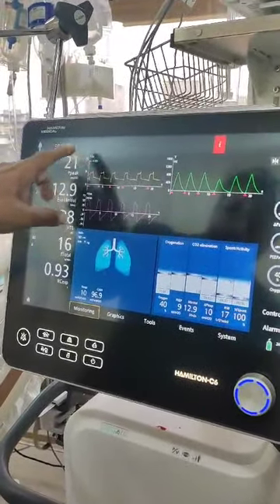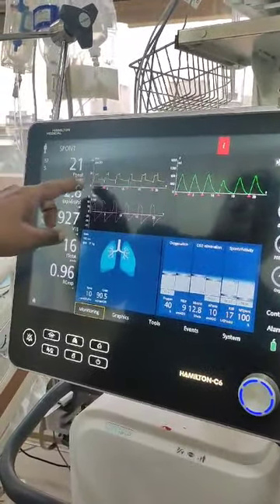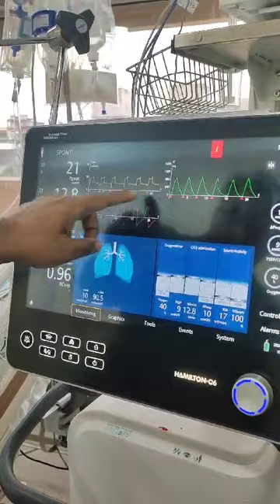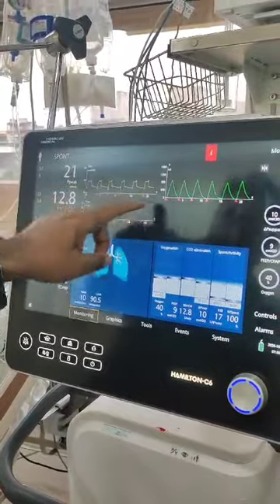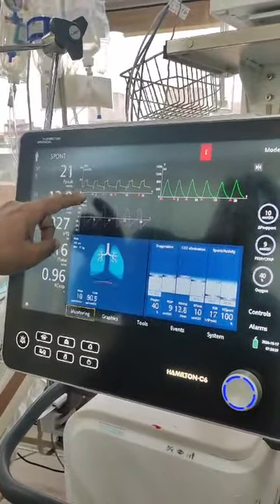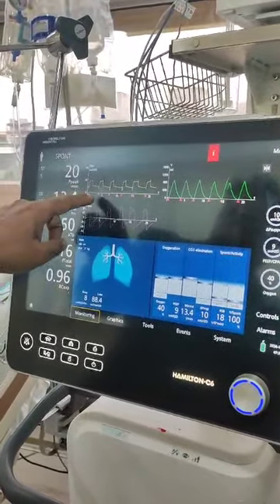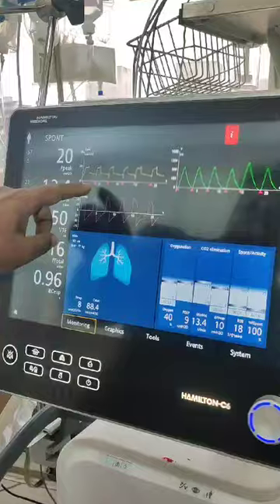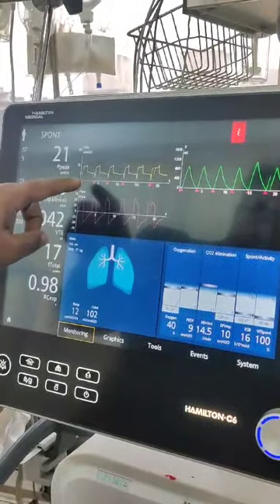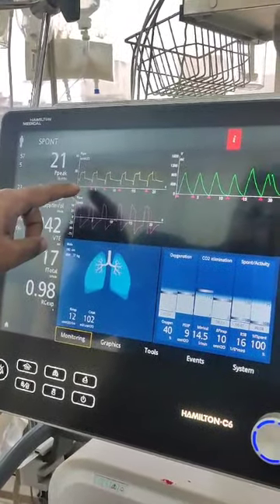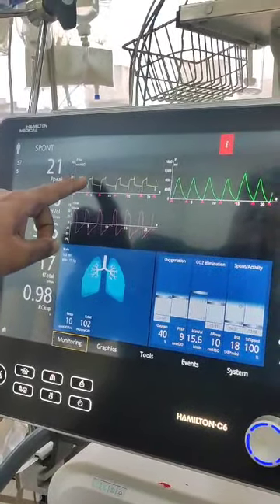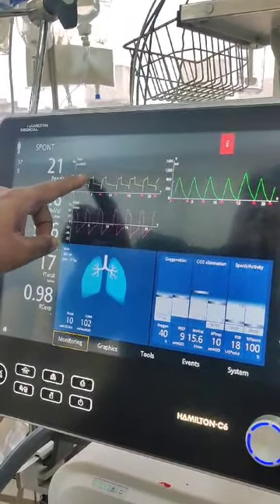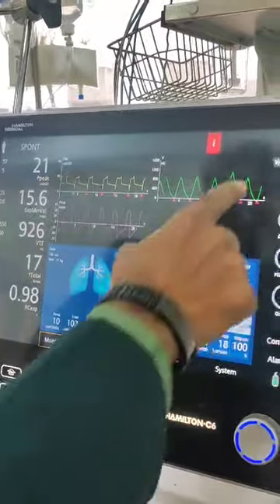In pressure support mode, please consider the pressure-time scalar. What you have here is a small start of inspiration — the red triangle actually indicates the start of inspiration, the trigger. And as we go up we see a small blip coming in over here.